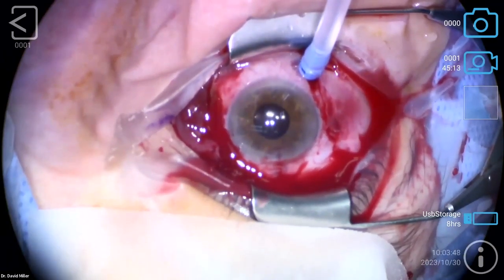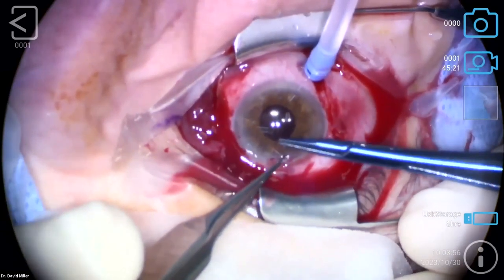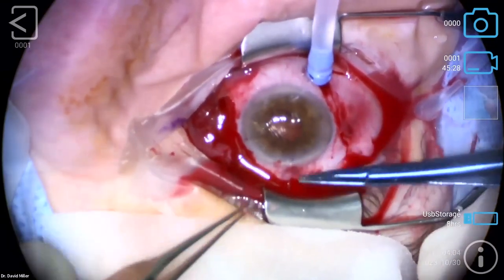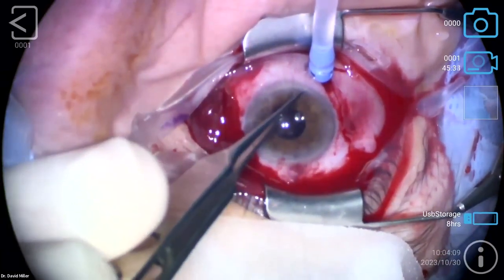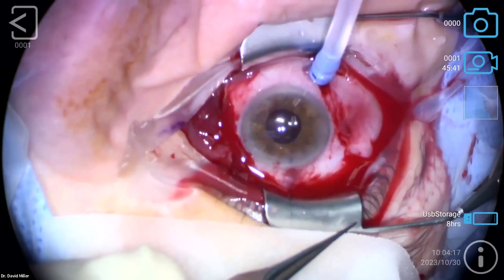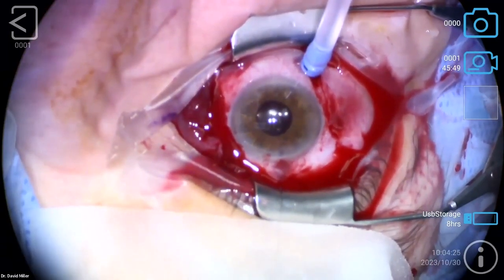So sometimes the smallest parts of the case can give you a little bit of trouble, but you just got to get it right. This is obviously not the critical part of the case. I clamp it up. But what I did both times in my tying of the knot, I had it locked. Let me put the infusion on for just a moment. Okay, now turn it off again. So our third try here. Can you cut this for me? And then the tires.